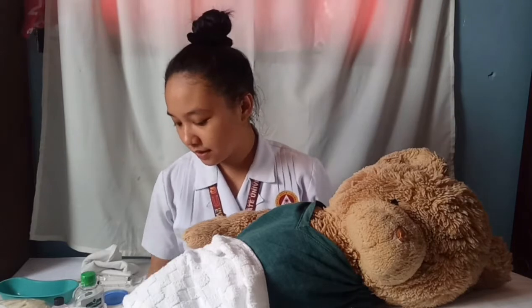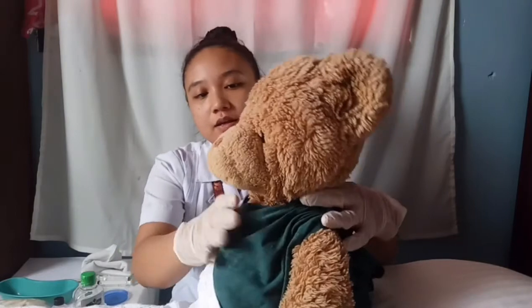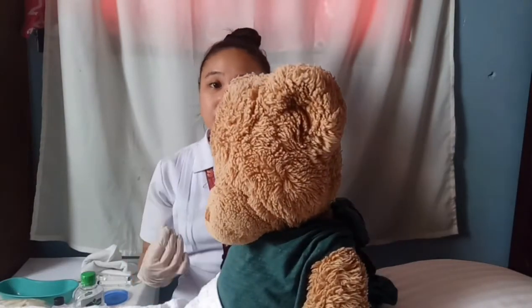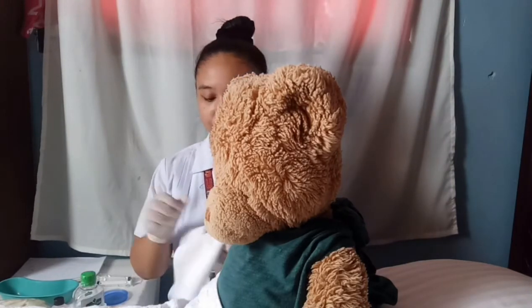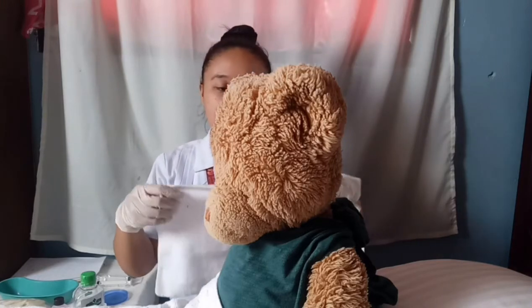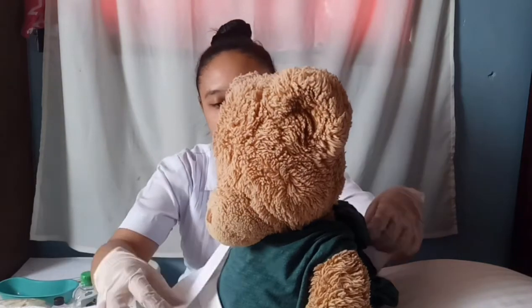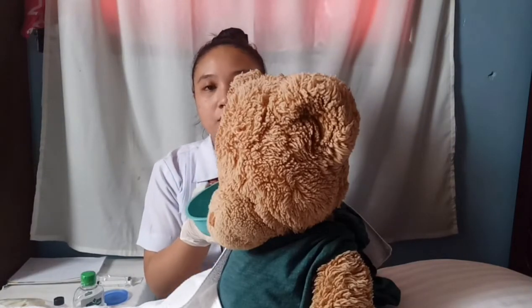And now for the otic irrigation, so remove this one. You need to assist the client in a sitting or lying position with the head turned toward the affected area. So, sir, let me help you in a sitting position. Like that. And then you need to place the moisture resistant towel around the shoulder of your patient, under the ear to be irrigated, like this, and then get the container and put it under the ear to be irrigated.